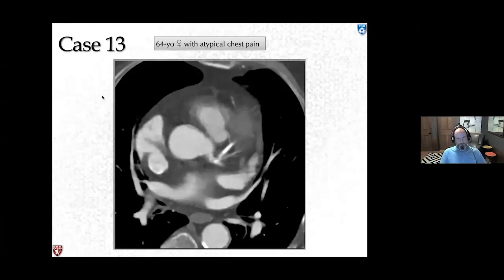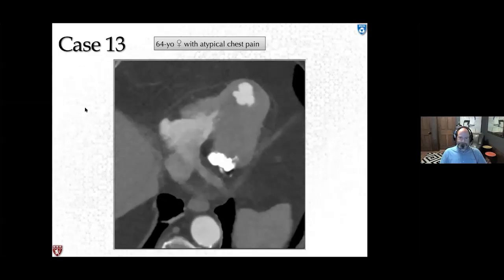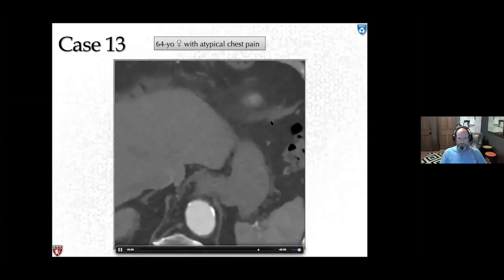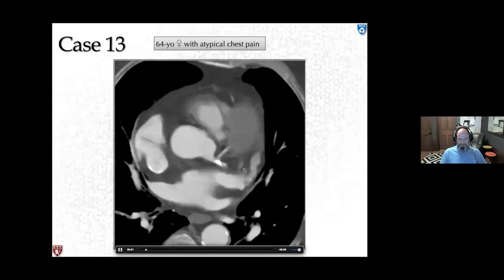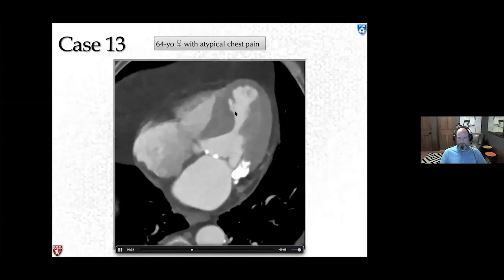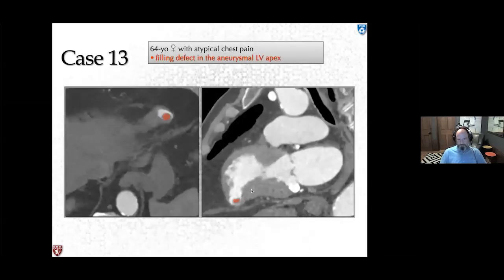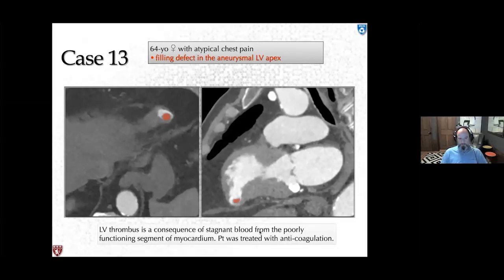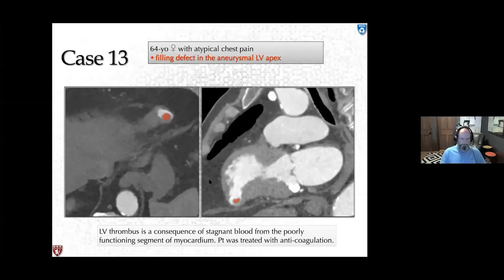Case 13: a 64-year-old female with atypical chest pain. Contrast-enhanced CT shows focal thinning and ballooning of the left ventricular apex with a filling defect — consistent with LV thrombus in an aneurysmal LV apex, in the setting of massive MAC and coronary artery disease. LV thrombus results from stagnant blood in a poorly functioning myocardial segment and is treated with anticoagulation. Radiologists must always check the LV apex and left atrial appendage for thrombus in all patients on all scans, as identifying this could prevent a stroke.